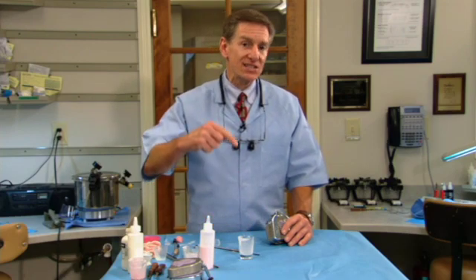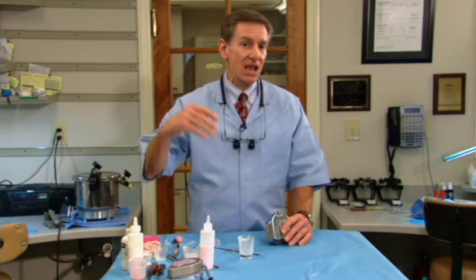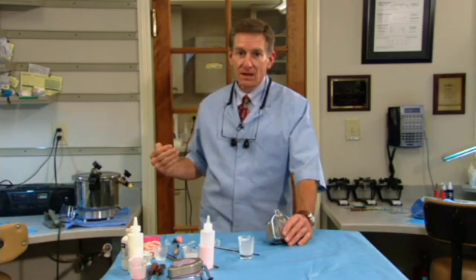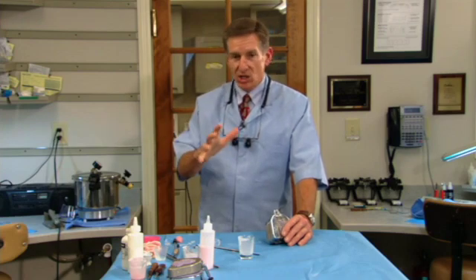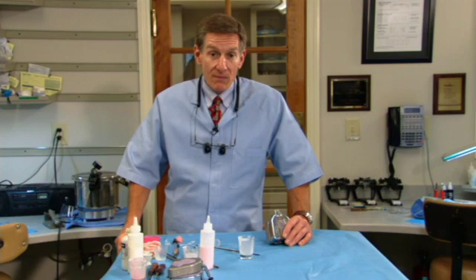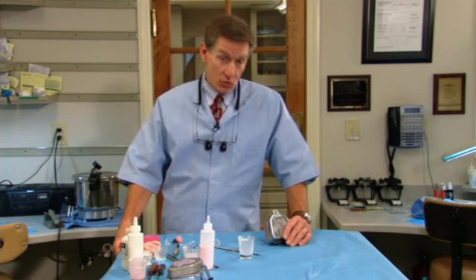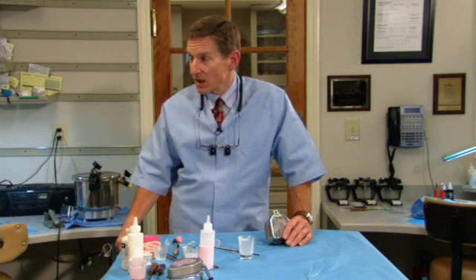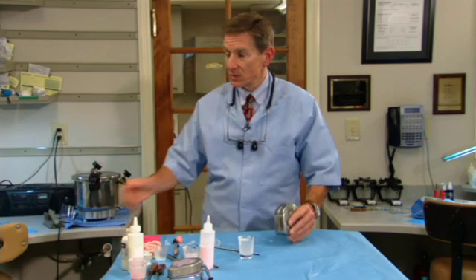And then you can pass the cost savings on to them because that's going to cost less than starting completely over again. Typically, we're only going to charge about $1,500 for that new denture. The lab then just makes indices, sets some teeth, and sends you back a final denture. You could run it through hydrocast if you wanted to, but in most instances we don't have to because we reline the clear duplicate.